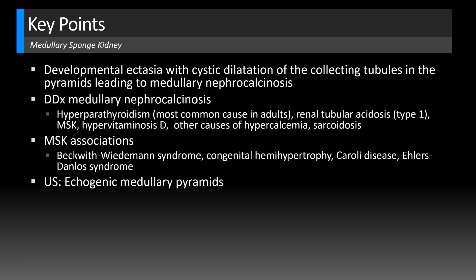On ultrasound, the renal pyramids will look echogenic. Interestingly, mild medullary nephrocalcinosis is actually better seen on ultrasound than on CT. In the early stages on ultrasound, the pyramids will be peripherally echogenic and centrally hypoechoic. As the disease evolves, the pyramids will become diffusely echogenic, and with progressive calcification, that's when you'll start to see the posterior acoustic shadowing, as in this case. So this case was an example of rather severe medullary sponge kidney.